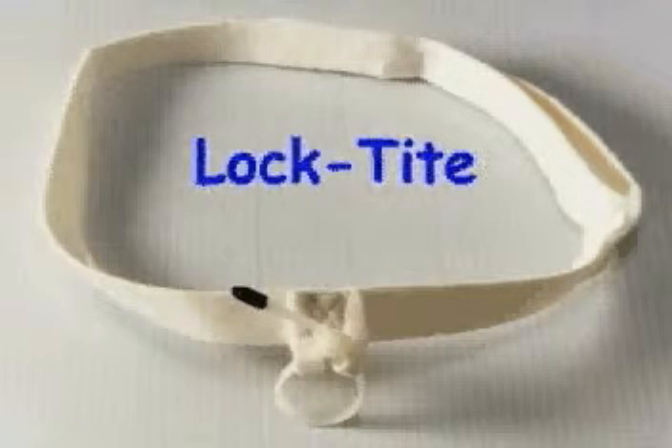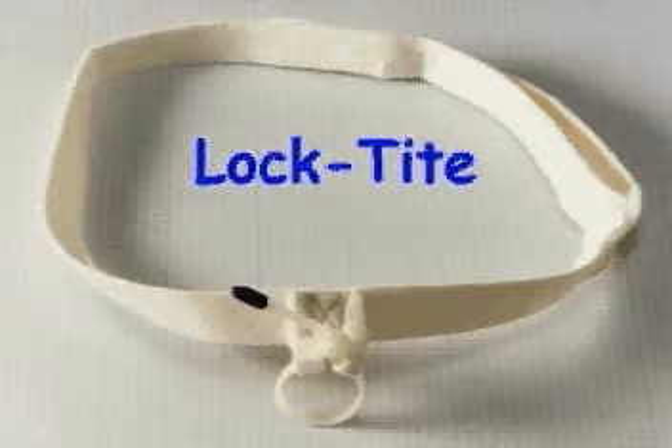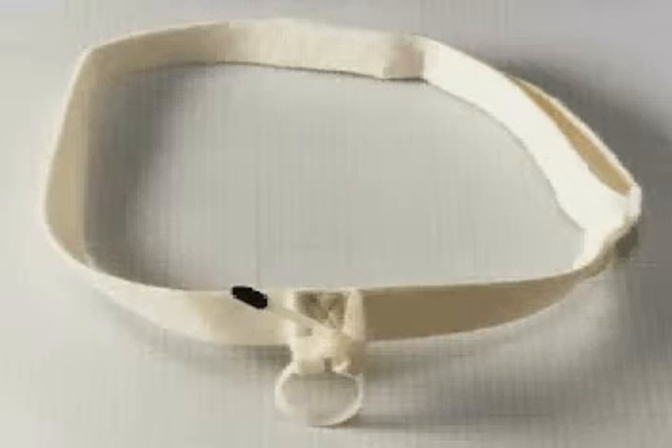Lock-Tite is our non-adhesive endotracheal tube holder used by burn centers and patients with excess facial hair. This product is adjustable on the face and has a releasable cable tie for easy repositioning of the endotracheal tube. It's great for non-combative sedated patients and when self-extubation is not a problem.